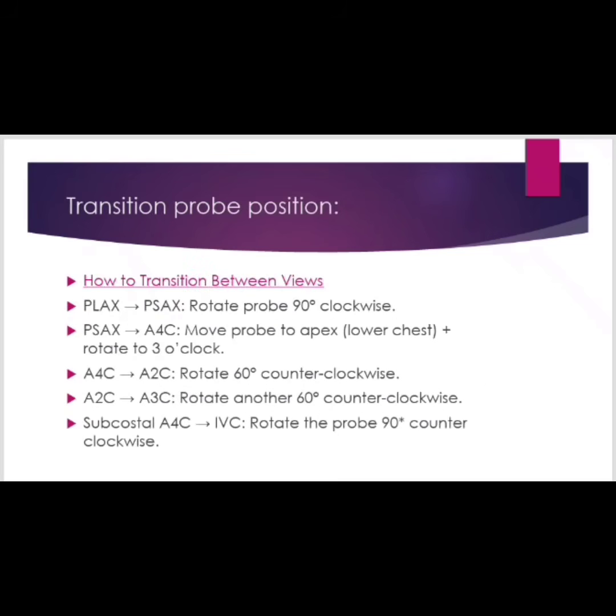This is the final recap of how to transition the probe from one view to another. That's it. You just learned how to move the probe to get all main echo views.